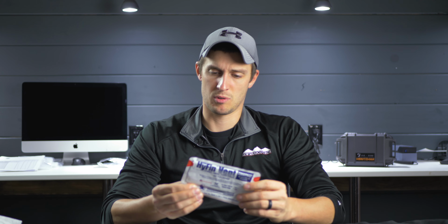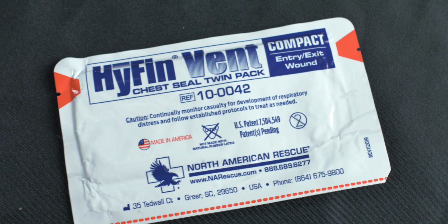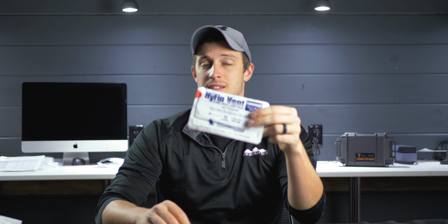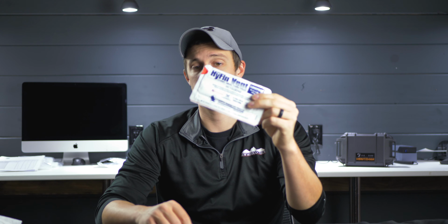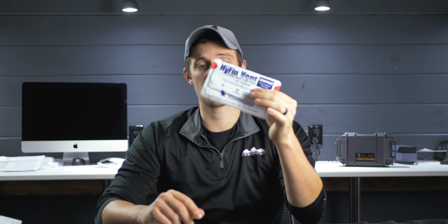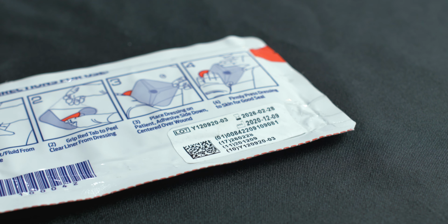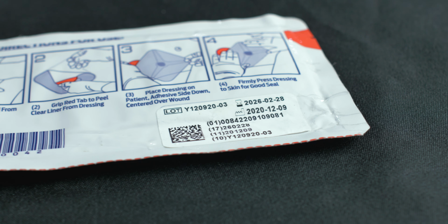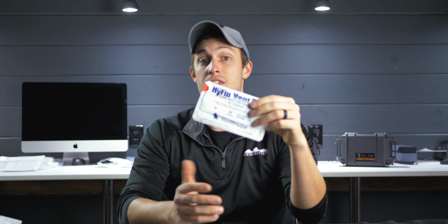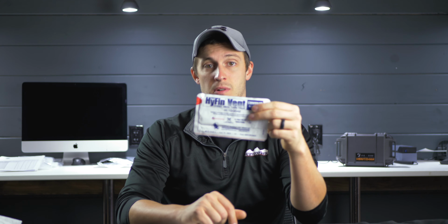Next up, we have one from 2 years ago. So the rest of these are actually from 2 years ago. This one has been sitting in our training box. This is some older ones that we use for some classes. So this has been basically in a controlled environment, has not been opened, but its manufacture date is December 9th of 2020. So that's going to be 23 months, or just a little over 23 months now on this one.